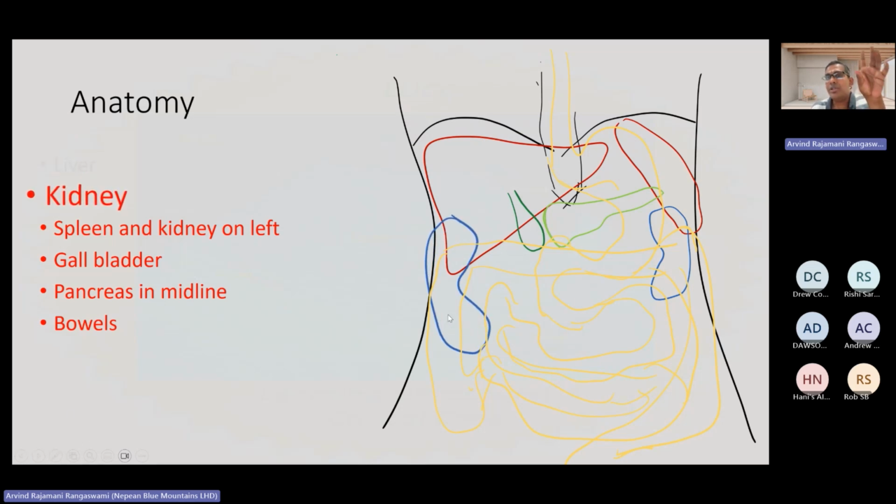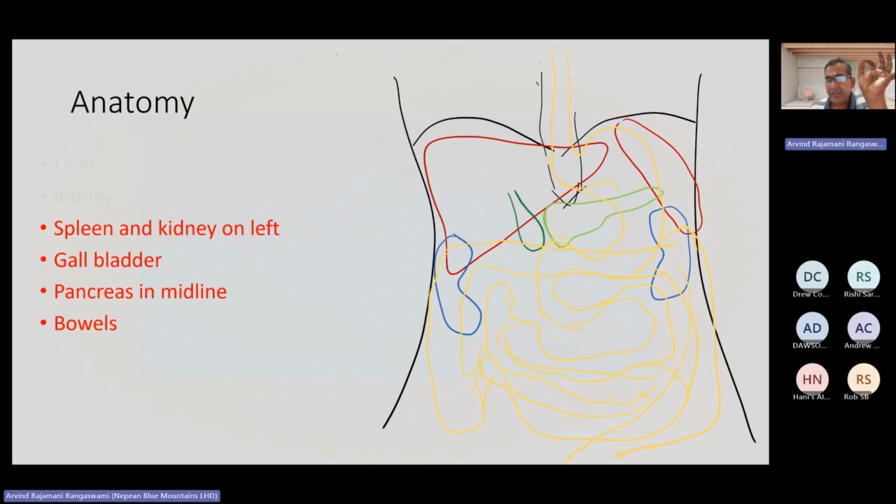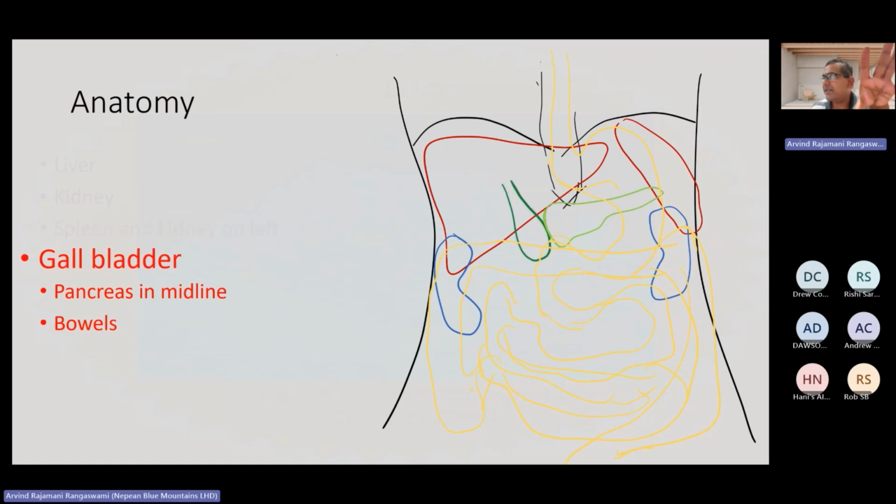One very important thing before I even start: I'd like you to avoid using words like above, below, etc. Make sure that you use anatomical terms when you're describing ultrasound, whether it is cardiac ultrasound or any ultrasound. Use the words superior, inferior, medial, lateral, and if you want to describe something, point towards the right shoulder, left hip, etc. This simple change in how you approach things will suddenly make it so much easier for you to modify a particular image that you get in order to rectify it. Okay, whichever ultrasound it is.